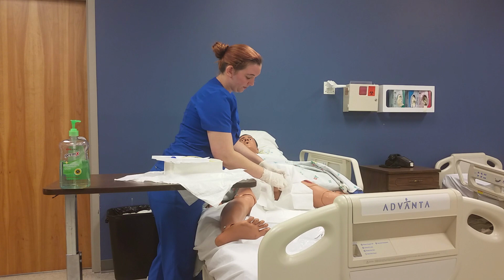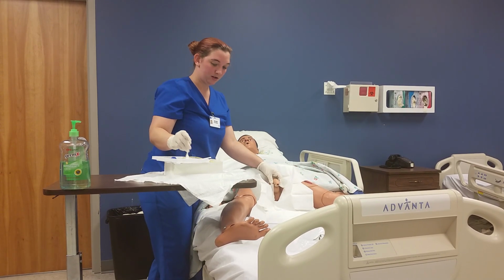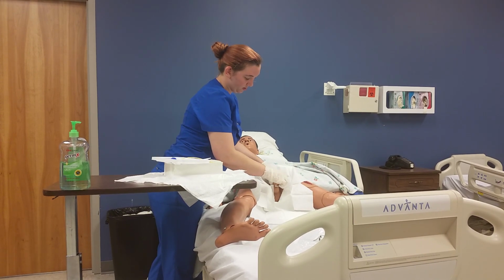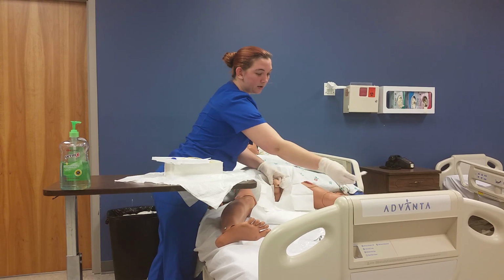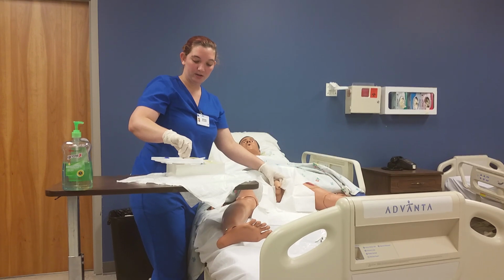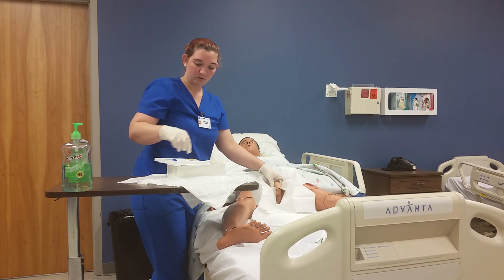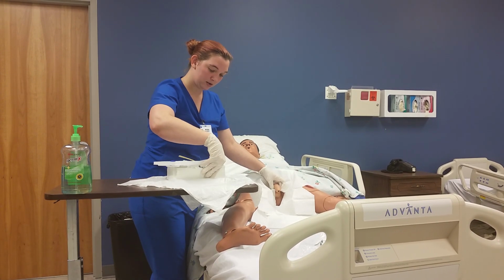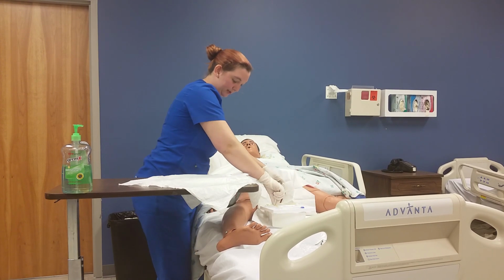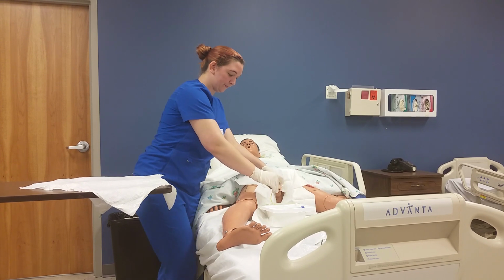The same thing here. Go out and around. And last one. Go out and around. Now that I'm done with this, I'm going to go ahead. This is lubricated already. We're going to take this whole thing and move it down here to the center where the patient is. I'm done with this table a little bit. I'm going to go ahead and get it out of my way.